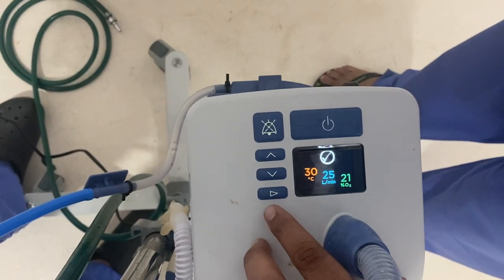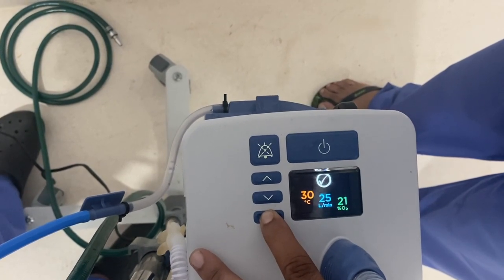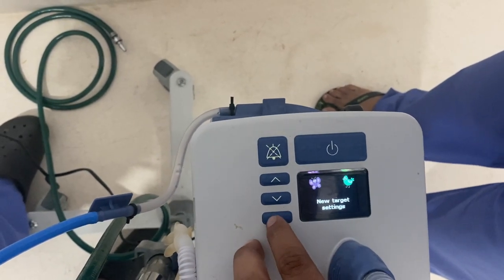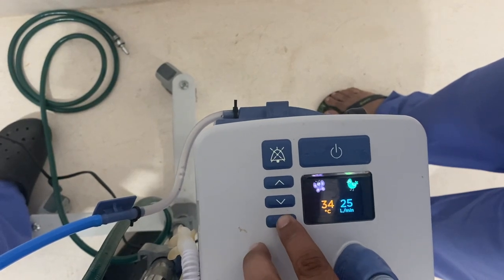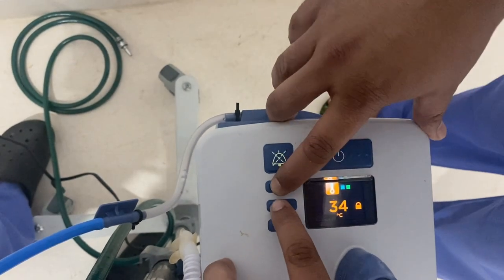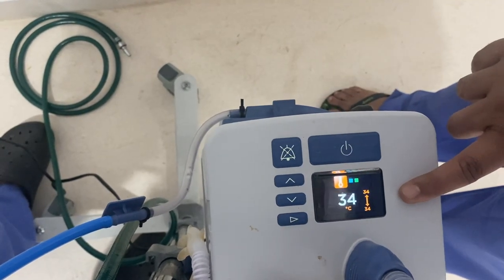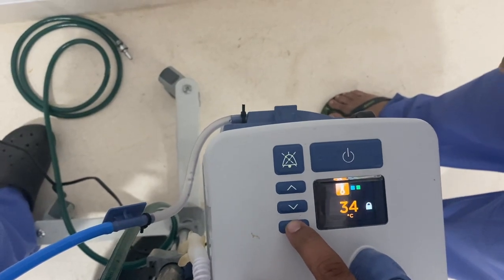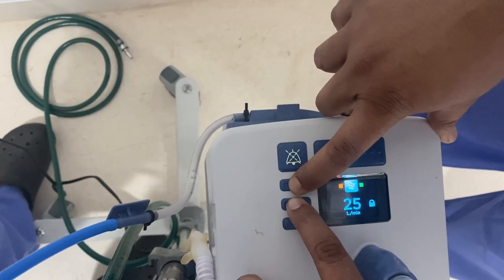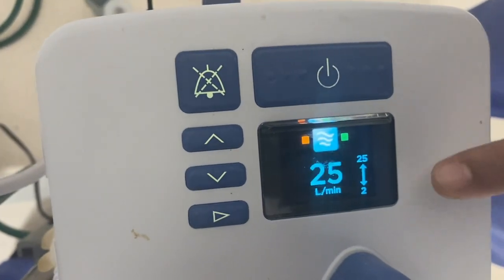For going into the pediatric mode, long press the mode button. This is the junior mode or pediatric mode. This restricts the temperature and the air flow to certain limits. As we can see, when you press the mode button for temperature, only 34 degrees Celsius is allowed in junior mode. When we go into the flow, because of the junior mode, the maximum of 25 liters per minute is allowed and the minimum of 2 liters per minute.